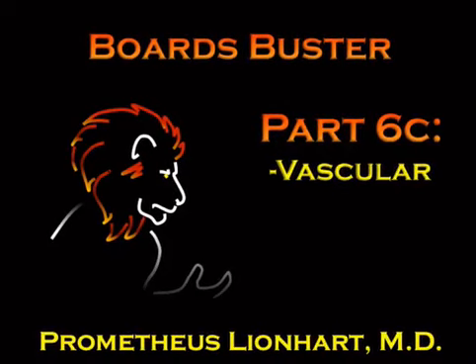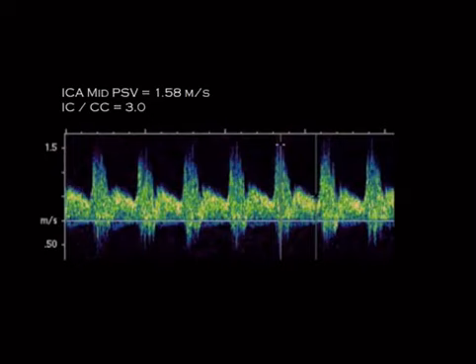Okay, guys, so this is the third part of the lecture series. This is the vascular lecture. So starting off, we're going to do a little bit of carotid Doppler.